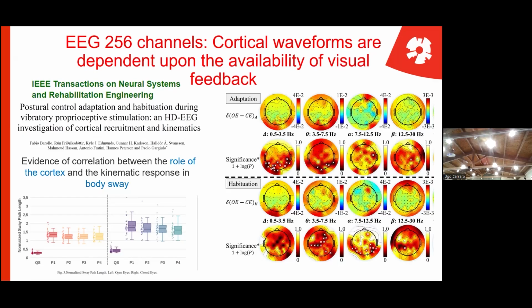If they are speaking about history, if they are speaking about geography, if they discuss muscles, then by hearing the conversation, we can reconstruct the narrative. So the same is with EEG. We need to engage the brain with something for which we expect a response. So evoked potentials, and then we read what is happening in the brain.